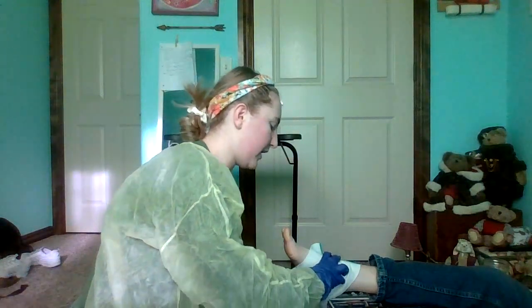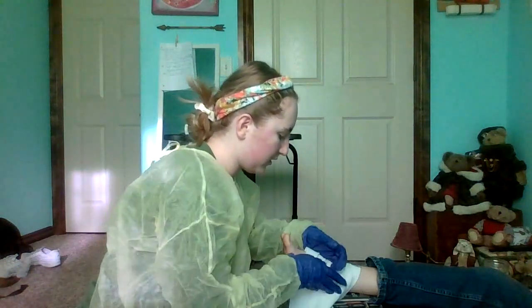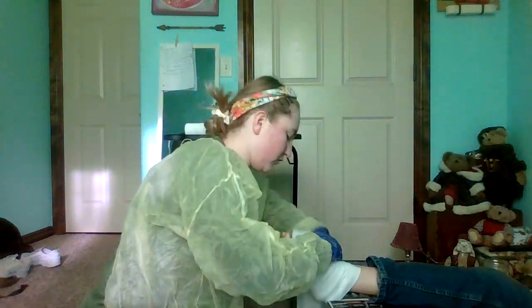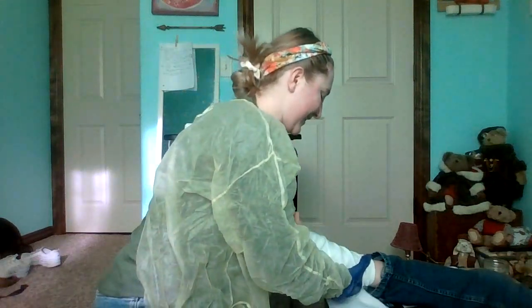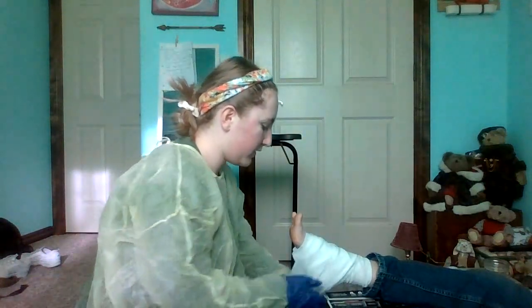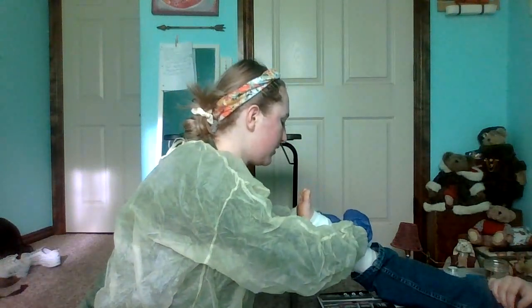And then we'll go in a figure 8 pattern. So I'll wrap it around the foot twice. You want to make sure it's decently tight to hold the dressing in, but not too tight. And then we'll go into that figure 8 pattern. So you go around and then you'll wrap up around the ankle. Then you'll come back down, wrap around the foot, go back up, wrap around the ankle. One more time. And this actually has a really nice Velcro strap that you can strap onto it.